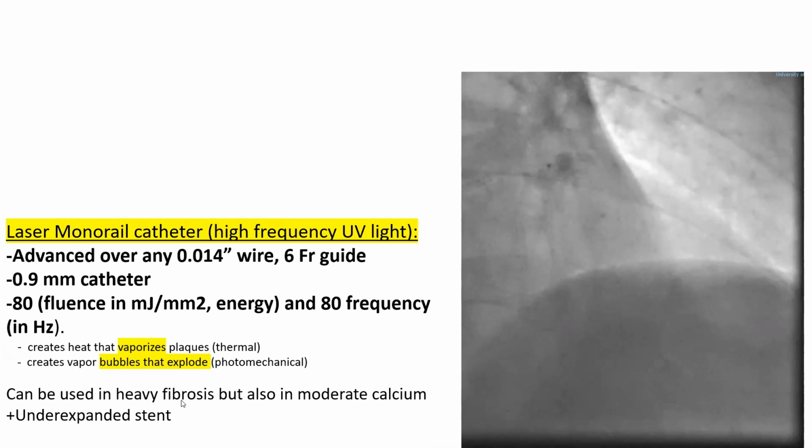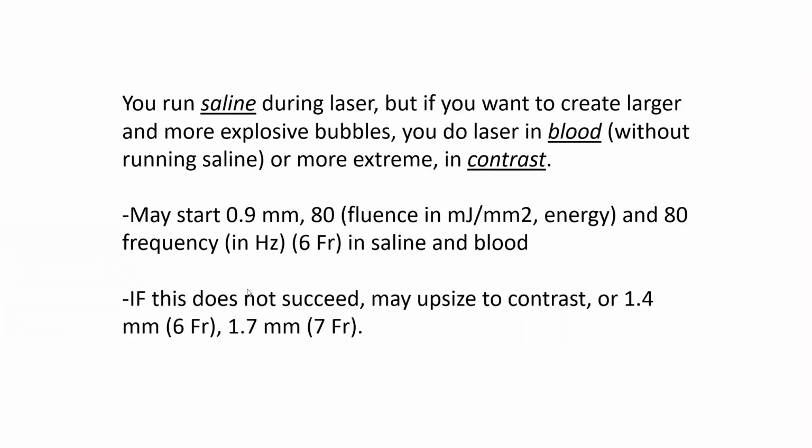Now, laser can be used in heavy fibrosis, but also in moderate calcium, and it is very valuable for underexpanded stent. We set it up in terms of energy or fluence usually at 80, and in terms of frequency, 40 to 80, but usually we use 80. And this is here the laser catheter tip.